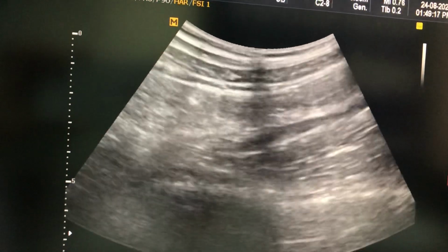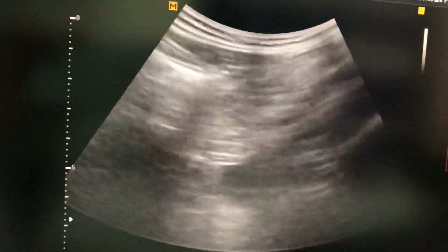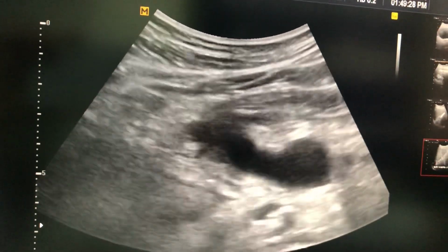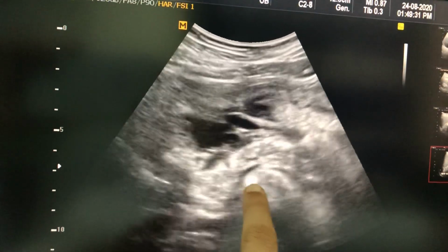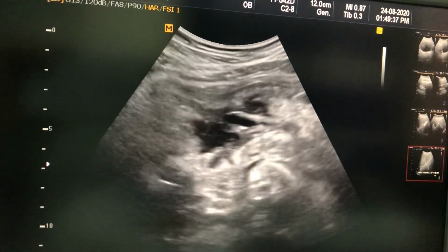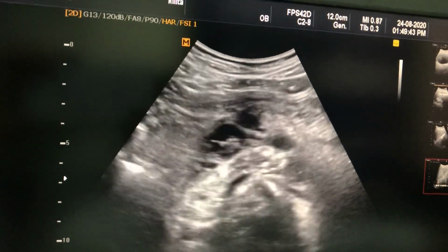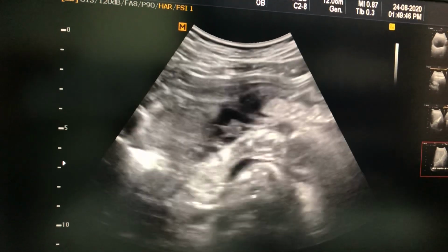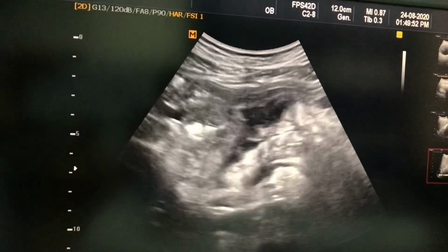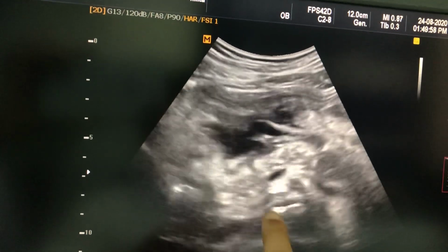If we take the longitudinal section, it is not clearly appreciated. Peripancreatic collection. And this pancreas is diffusely edematous and shows heterogeneous texture, hyperechoic and a little bit hypoechoic. Hyperechoic texture is more in the parenchyma. This is the common bile duct. This is the portal vein.